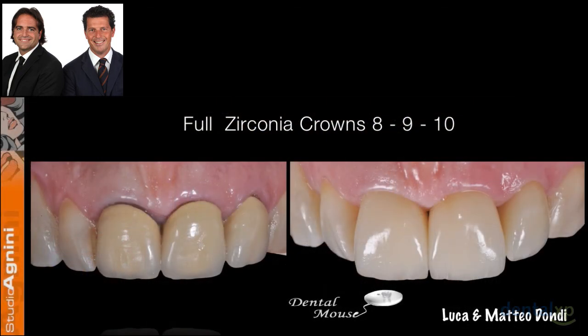And so you see a before and after of these 3 full zirconia crowns, 8, 9 and 10, where we managed to restore and recreate a nice aesthetic for the patient and correct not only the white aesthetic with the teeth but also the pink aesthetic.